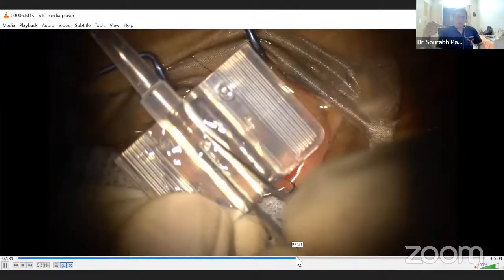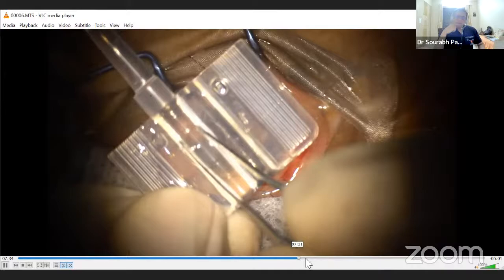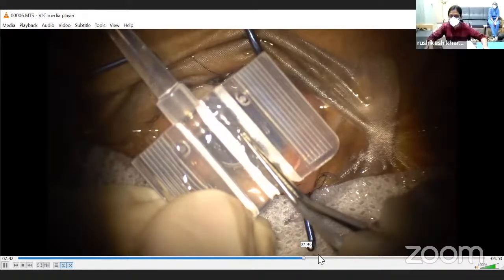And these plungers also have to be non-compressible plungers, with the silicone tip, na? So that plunger also is sometimes cut awkwardly, like at an angle, so they may get stuck in between. The IOL was not stuck. It was released, and I had only loaded this IOL, and checked outside before injecting also.